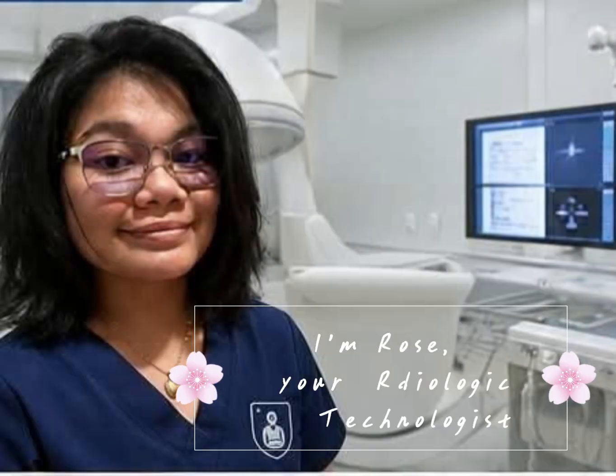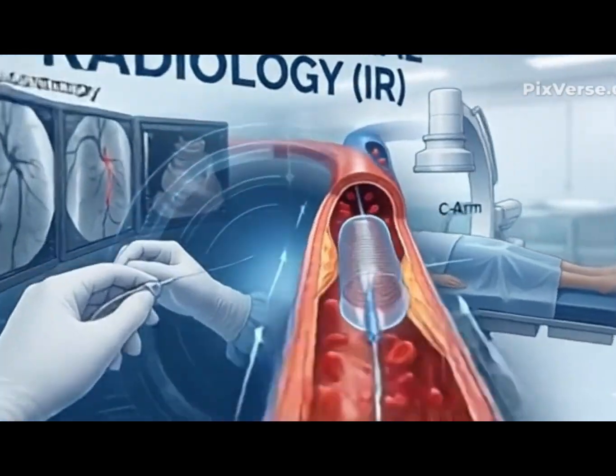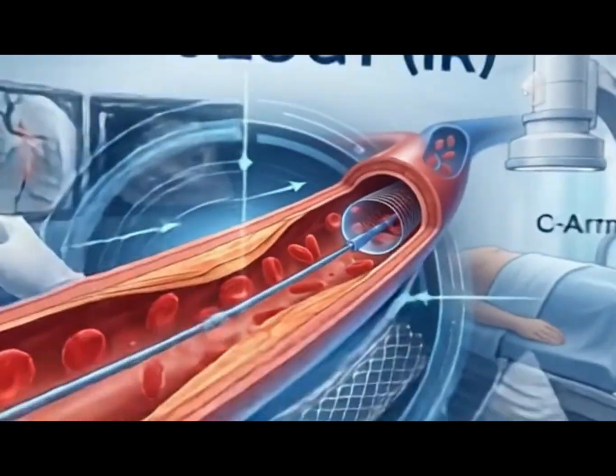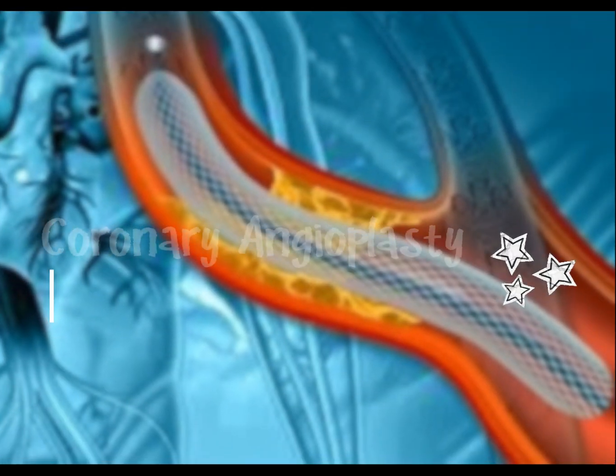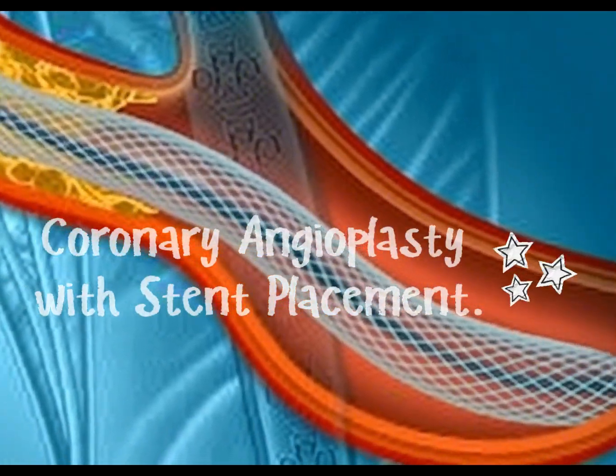I'll be your future radiologic technologist for today, and I'll be assisting you during an interventional radiologic procedure. And for today's procedure, it's called Coronary Angioplasty with Stent Placement.